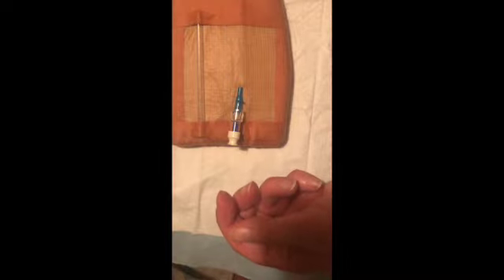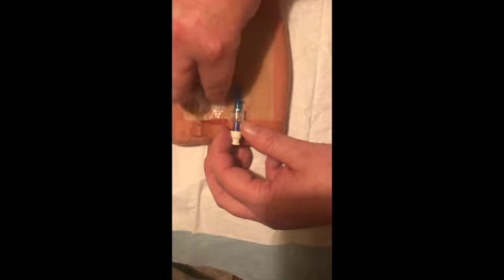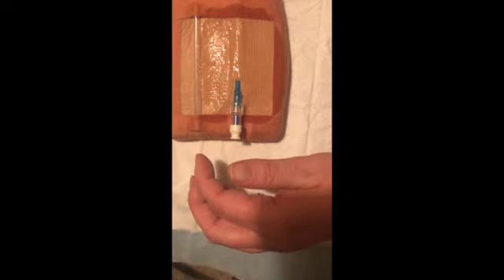Now you're inspecting the cannula site to ensure that the cannula can actually remain in situ. So you're doing a quick VIP assessment, looking for any redness, bleeding, phlebitis, anything that would indicate that you need to remove the cannula. And then with your chlorhexidine swab or wipe, you're cleaning the site underneath. And you want to push it down firmly so you don't have any air bubbles or gaps. Pinching, spreading. And you need to let that air dry.